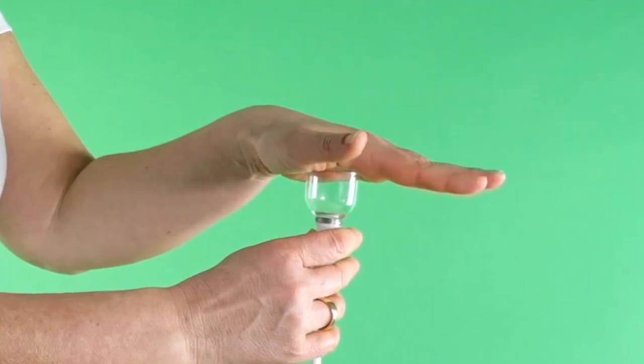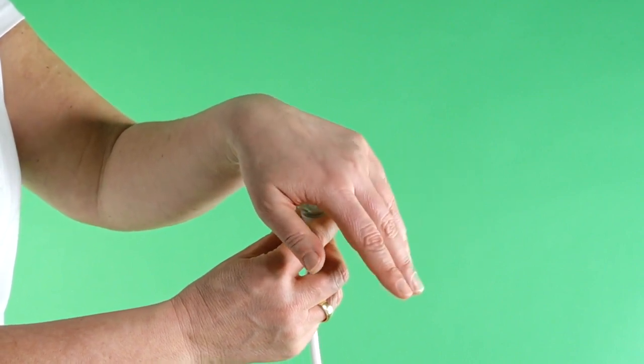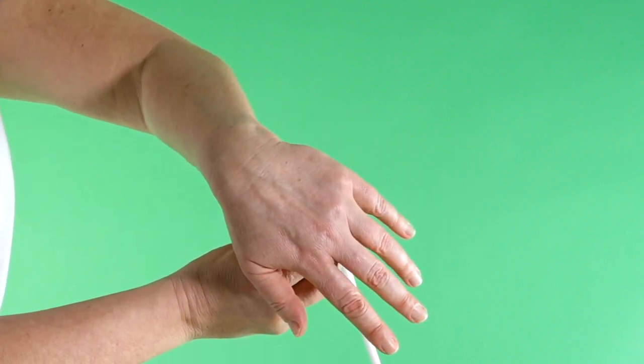These vibrations can set tissue up to 8 cm deep in motion, depending on where you apply the PPTM. Of course, this is also dependent on the BMI of the person in question. You can see the penetration more precisely here. My hand is about as thick as the muscles in my back. If I now put the cup on the palm of my hand, you can see from the back of my hand how much you can move the tissue.